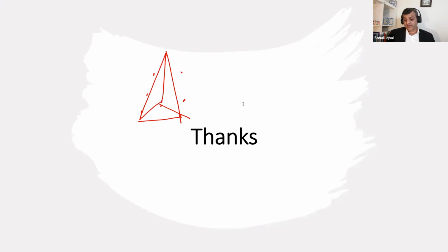So it depends. For example, nowadays we are trying to compute a problem, and for each and every image it's taking 30 minutes, which is not acceptable. So the next thing we can do is only consider the appropriate point cloud, as we did in this study. Choosing a point cloud is all about balance: how to choose a point cloud which is related to the homotopy type of the underlying or associated manifold, and the computational limits. So it's a balance.